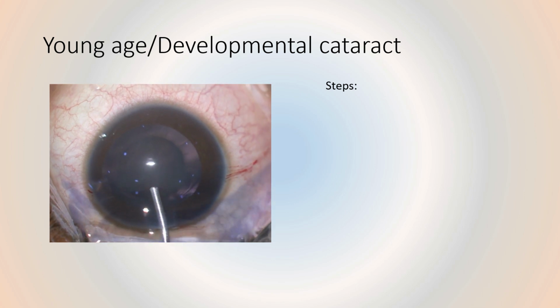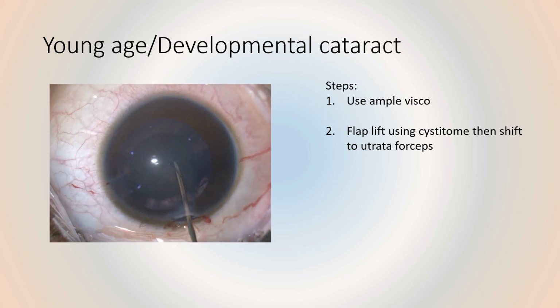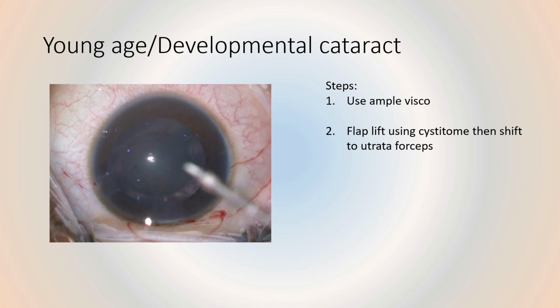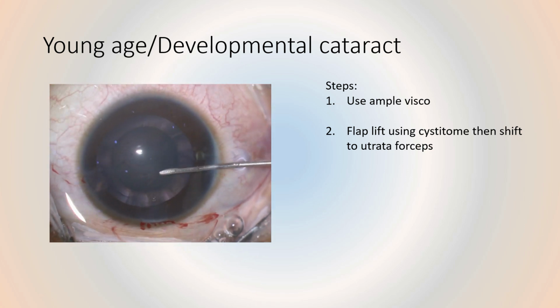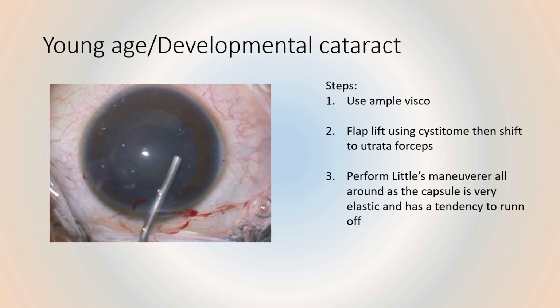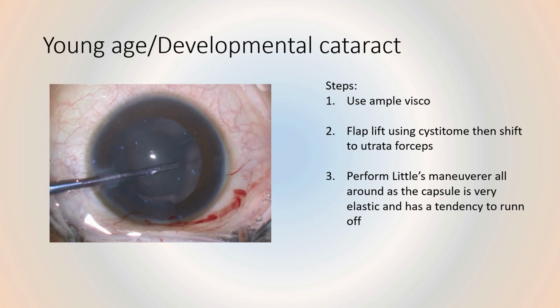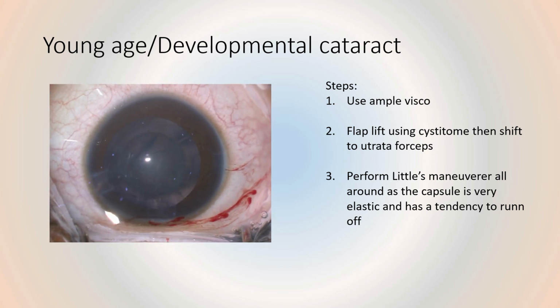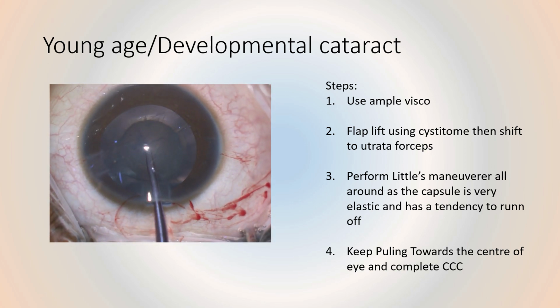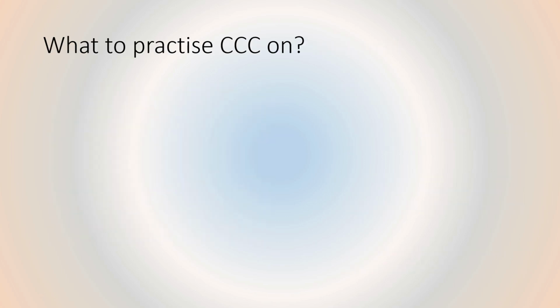In young age or developmental cataract, the capsule is very elastic, so use ample visco. The flap should be lifted using a cystitome, and then shift to either Utrata forceps or microrhexis forceps. Basically, Little's maneuver is performed all around the capsule. Keep pulling the capsule towards the center of the eye at each step, and then complete the capsulorhexis.